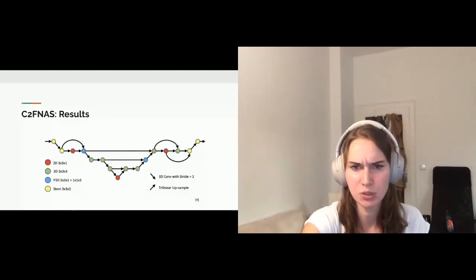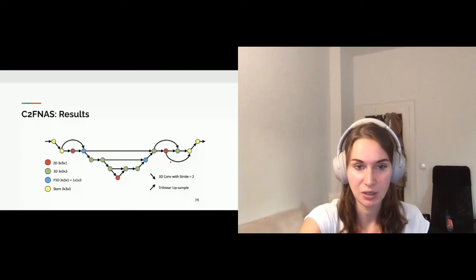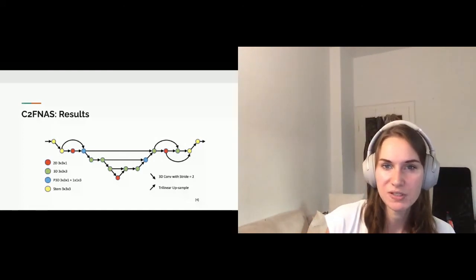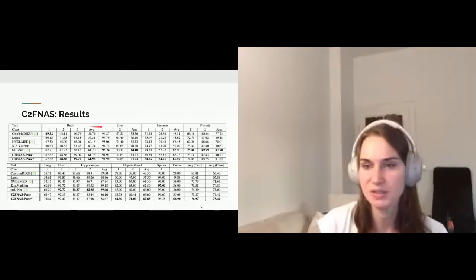There's some variation going on with additional skip connections in these layers here, but essentially it looks very similar to UNet. And they then proceed to evaluate this model on all of the data sets. The parts come from this data set they use it on.